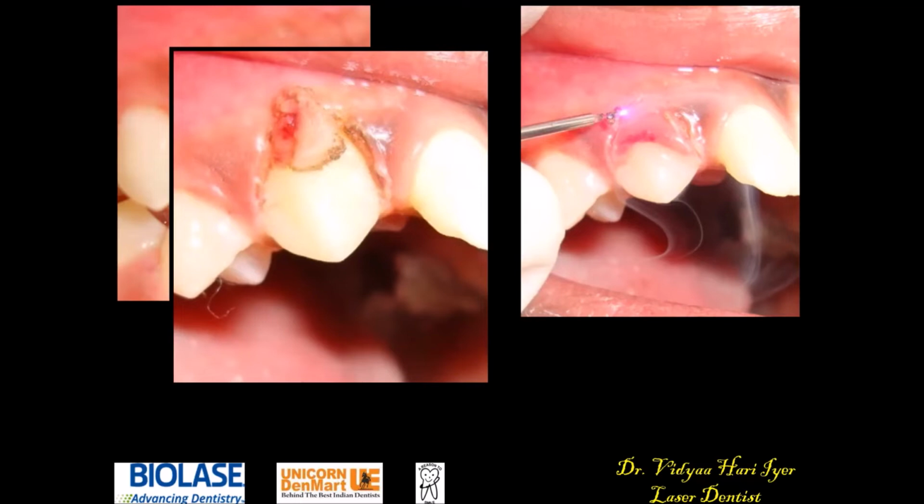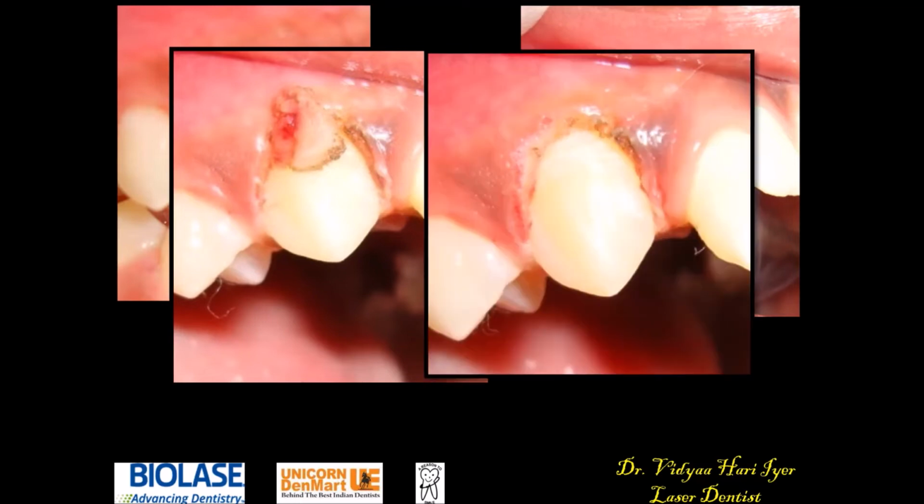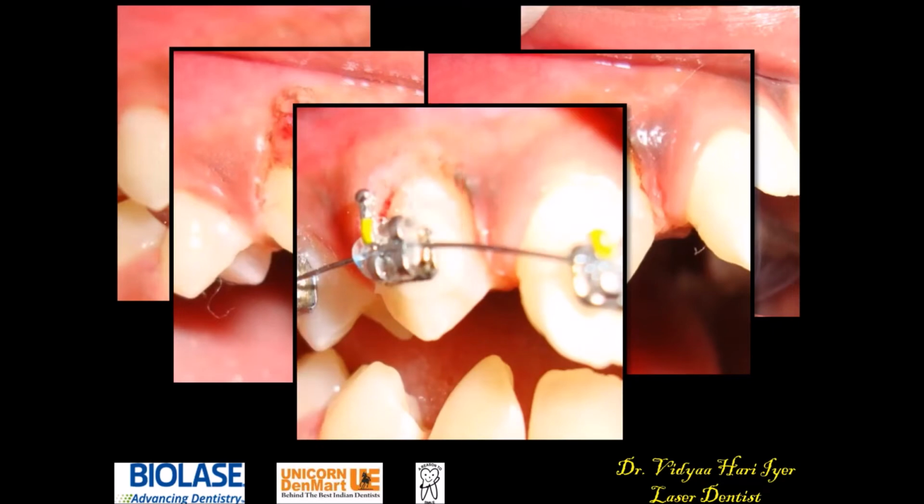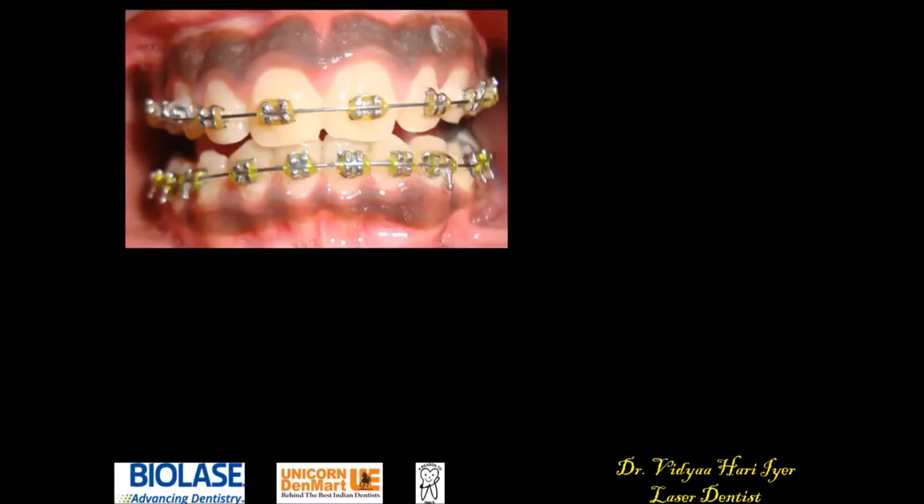So this is the advantage of lasers, my dear friends, and you will be able to see a very clean cut. And now you can see that the tooth is exposed and now it is ready for clips or orthodontic treatment. So the patient is comfortable because they have had a single sitting procedure. The doctor is comfortable because the patient does not feel any pain. And overall, if you look at it, this is a very stress-free environment. And I'm sure all of us have enough stress in our lives, right? And you would want to have a stress-free environment, especially when you are going to a dentist right now.